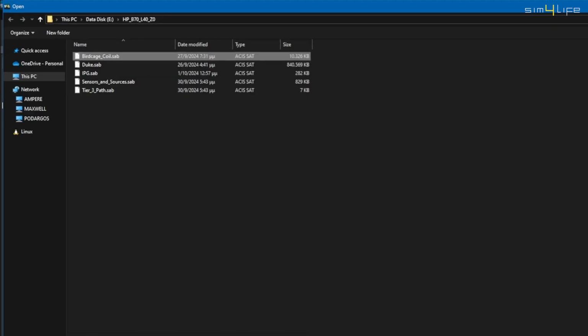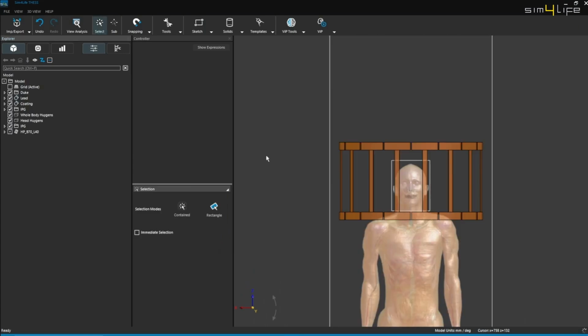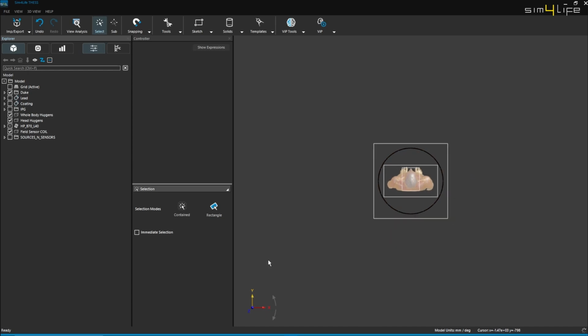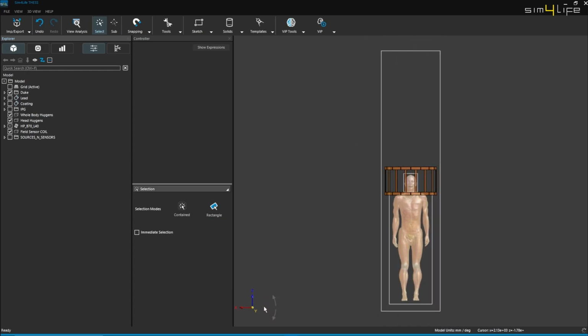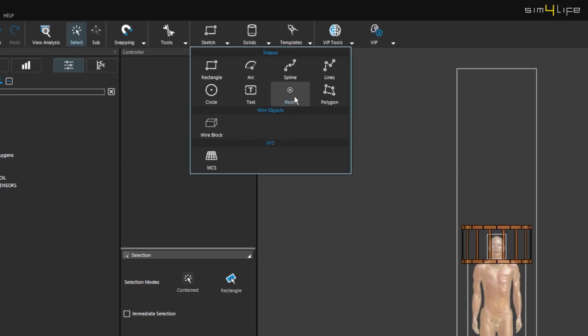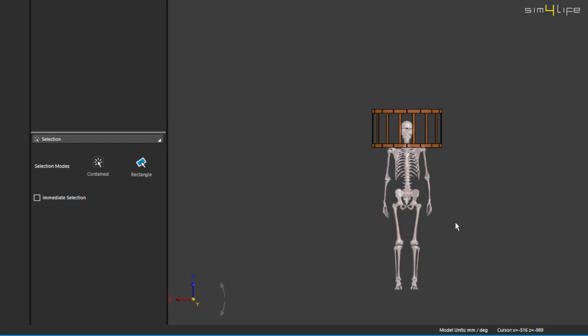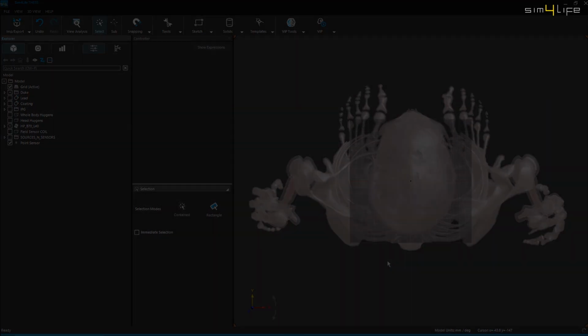Now we import the birdcage coil from the birdcage coil library. We position Duke such that the center of his head aligns perfectly with the coil's isocenter. At this point, all the necessary CAD models, sensors, and sources are already prepared. Additionally, to monitor and evaluate the convergence level of the simulations, we create a point sensor placed at the center of Duke's head, which also corresponds to the coil's isocenter.